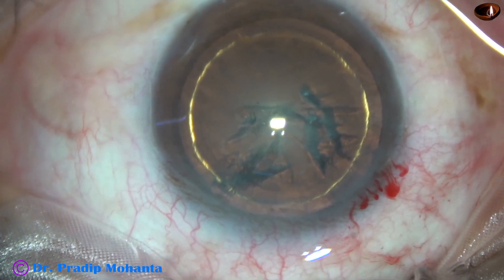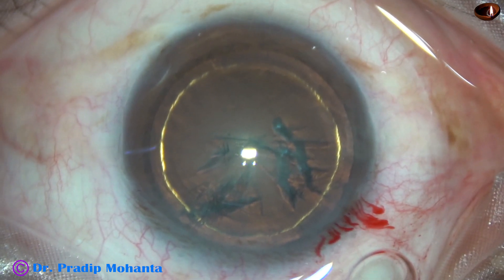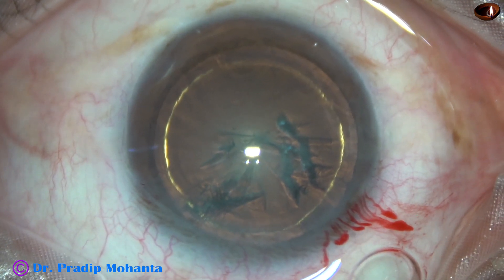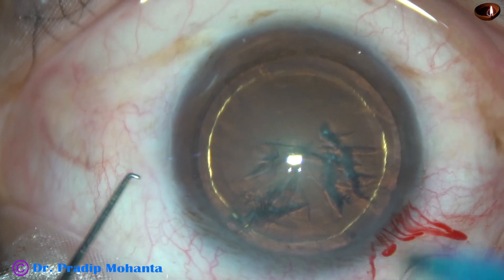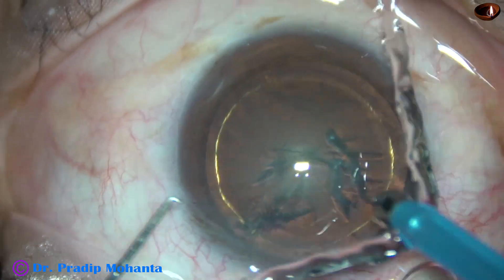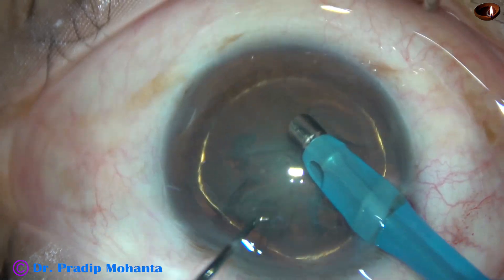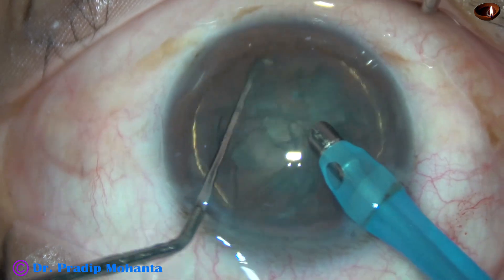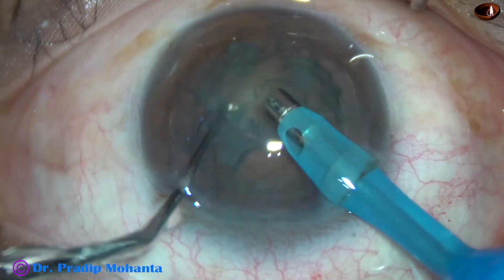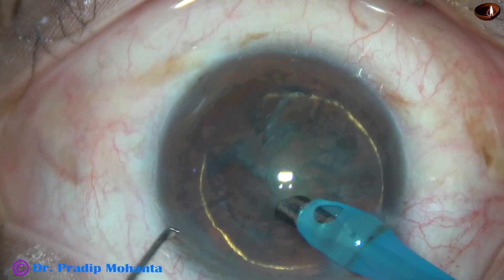We are going to see the carousel technique in this case. The tip of the phaco needle is introduced with its bevel down, that is towards the lens mass. Some superficial cortical lens matter is removed. The nucleus is rotated nicely. Finally, for the carousel technique, the nucleus should rotate freely. Now watch the carousel technique.